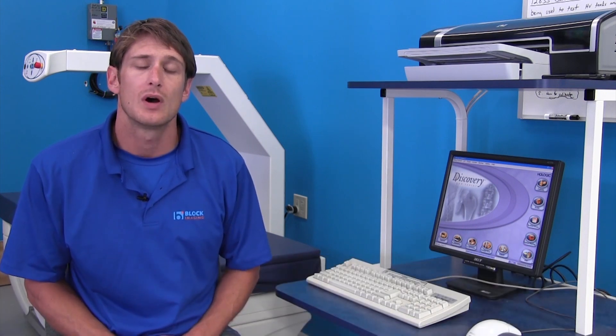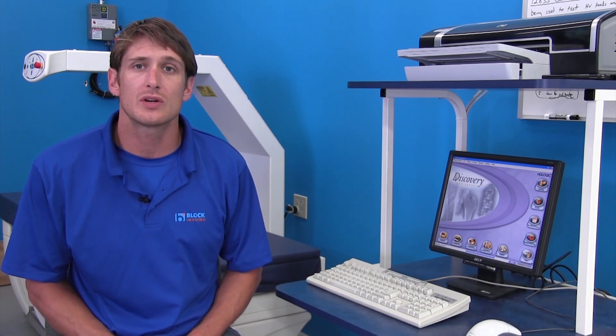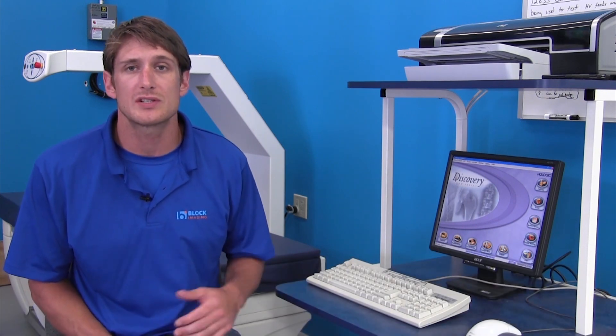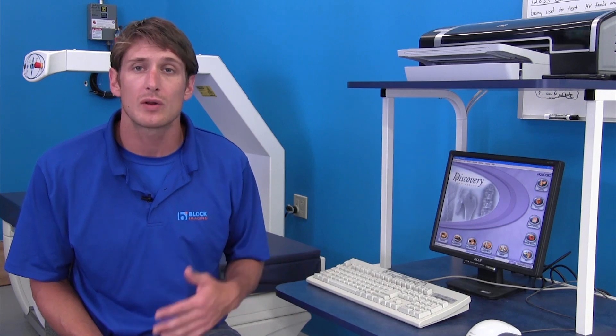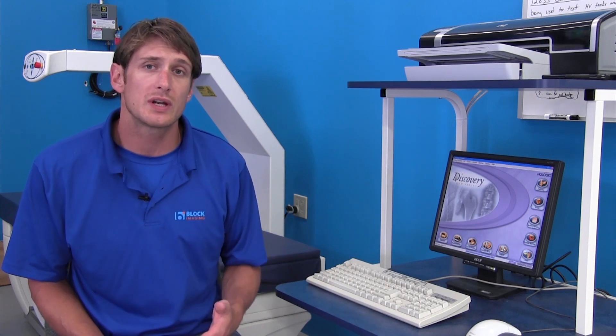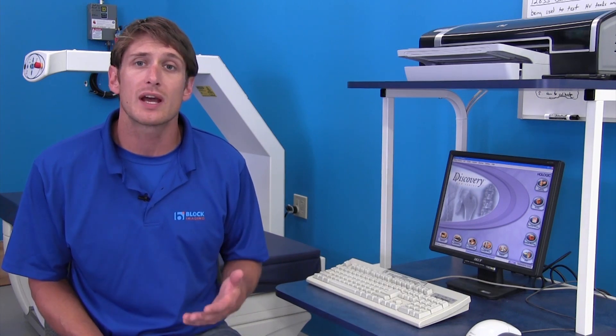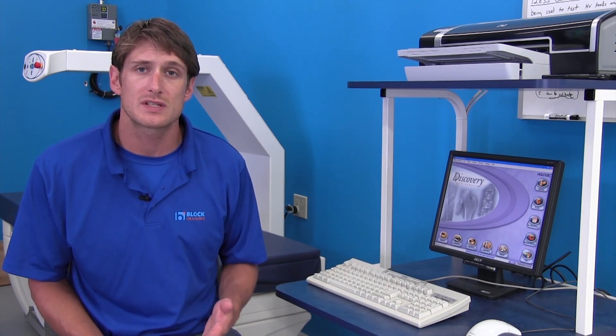Hi, here to talk about one of the most important troubleshooting techniques you can do with your Hologic DEXA system. Other than looking at your QC plots, determining if they're high or low, you can actually get in and look at error logs within the system.